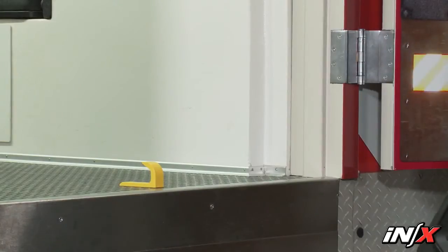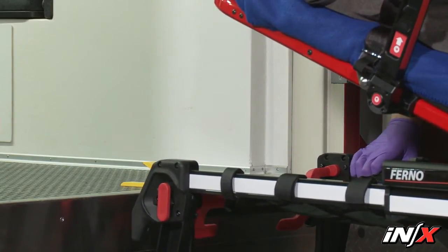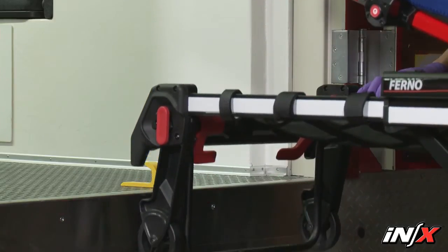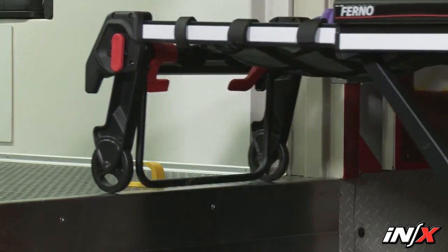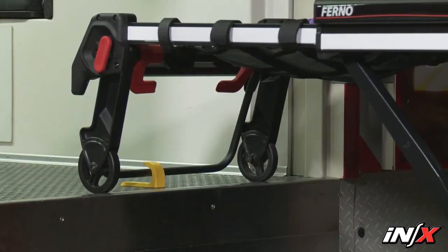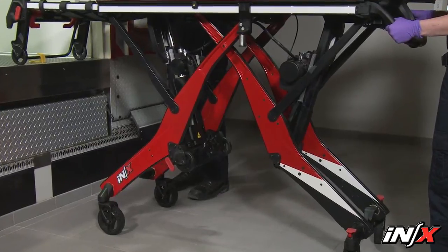Users can program the NX so it stops automatically at the proper loading height for the assigned ambulance. To set or change the loading height, raise or lower the NX until the loading wheels roll directly onto the ambulance floor. Make sure the wheels are resting on the floor, the safety bar is caught by the safety hook, and that the loading end legs have not lifted off the ground.